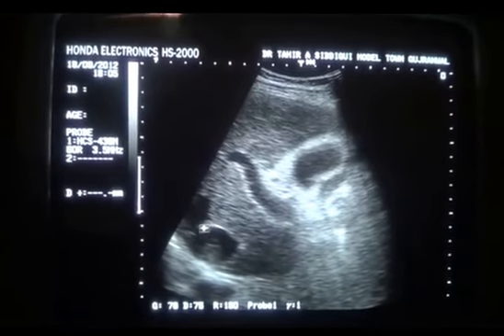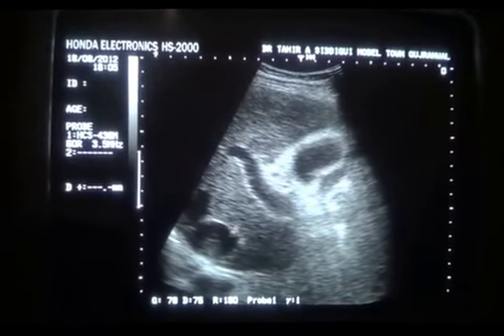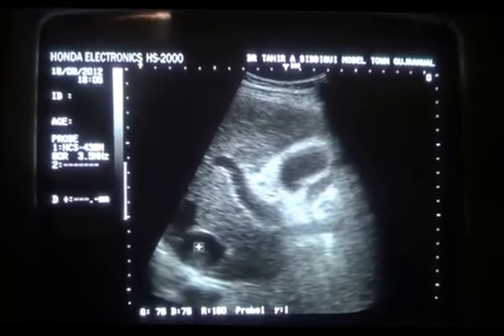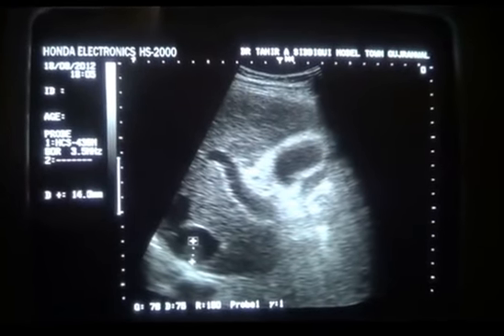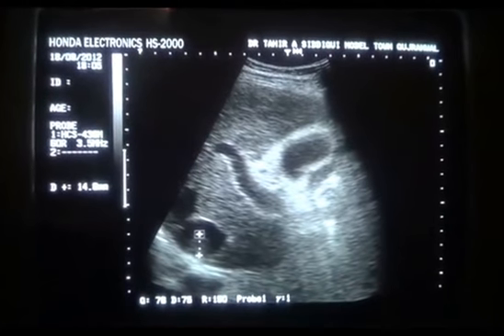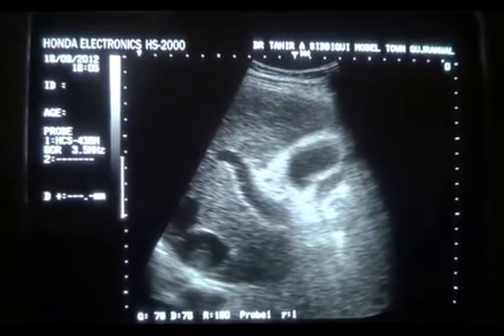Now this is the inferior vena cava, this is the portal vein, IVC, and you see an evenly echogenic area within the IVC, measuring approximately 14 millimeters.